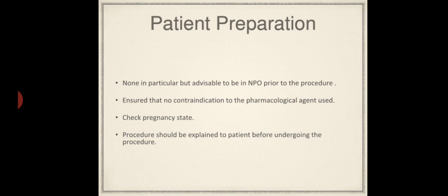Next is the patient preparation. None in particular, but it is advisable to be NPO prior to the procedure. Ensure that there is no contraindication to the pharmacological agent used. Check pregnancy state as radiation is used. The procedure should be explained to the patient before undergoing it.